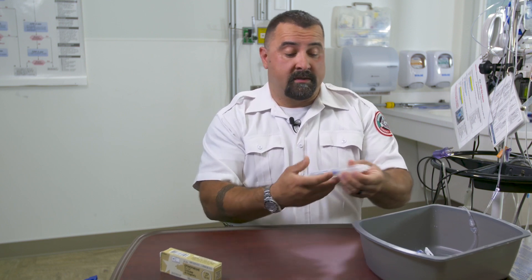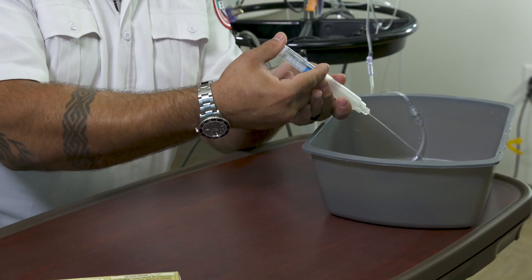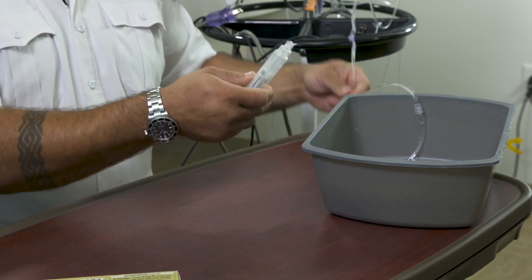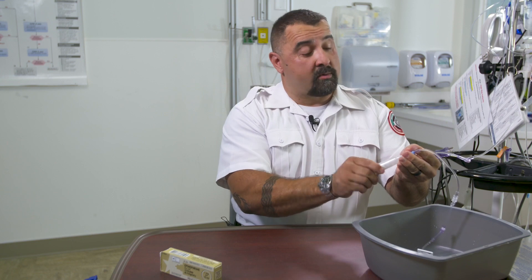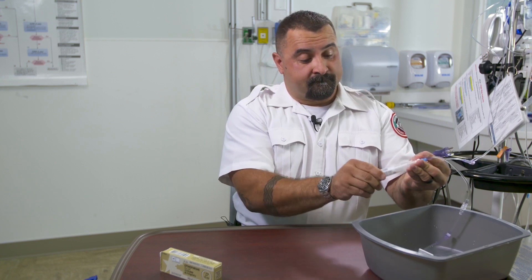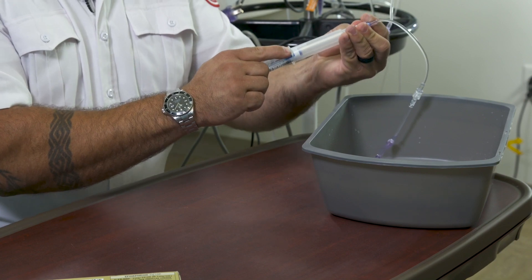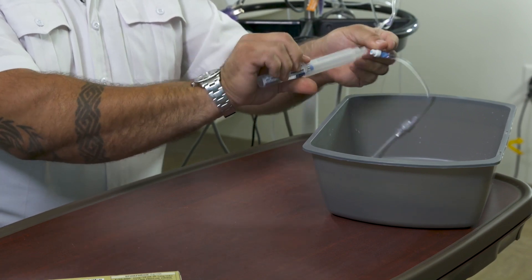We're going to learn how to change a preload of 0.1 milligrams per milliliter of epinephrine into 0.01 milligrams per milliliter. What we do is take the preload, remove 9 milliliters of fluid, and then draw 9 mLs from a normal saline bag. You now have the concentration of 0.01 milligrams per milliliter.